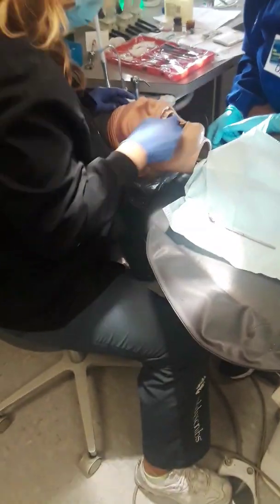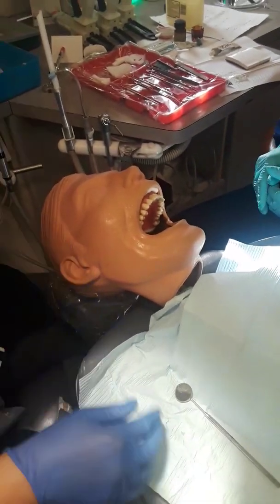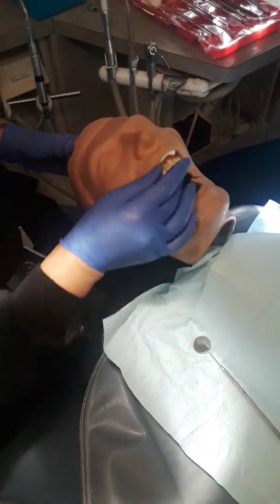I'm done. I'm gonna try it in. What do you think? Doesn't look bad, huh? Yeah, it's on the margin. All right, so my temporary crown is fabricated. We're gonna try it in.